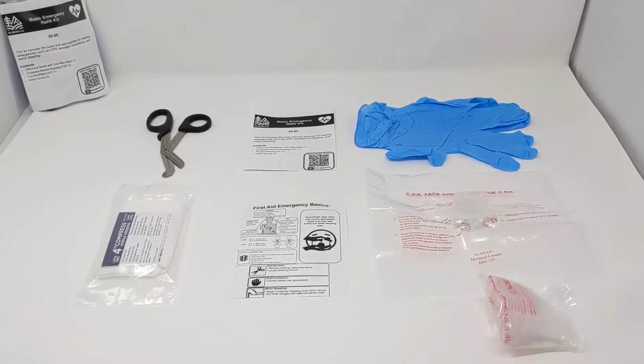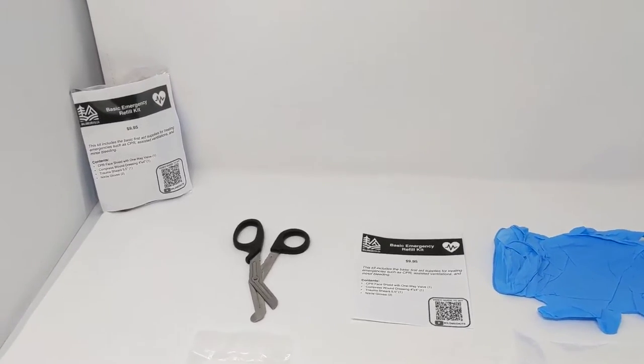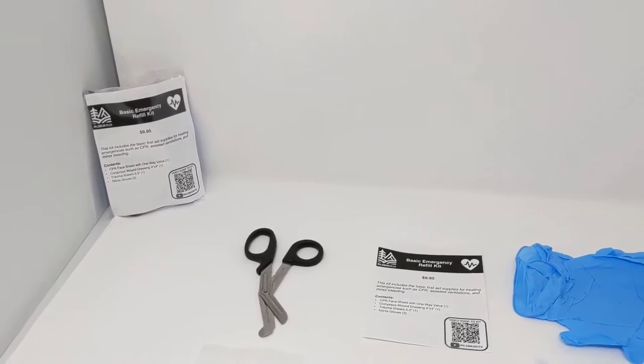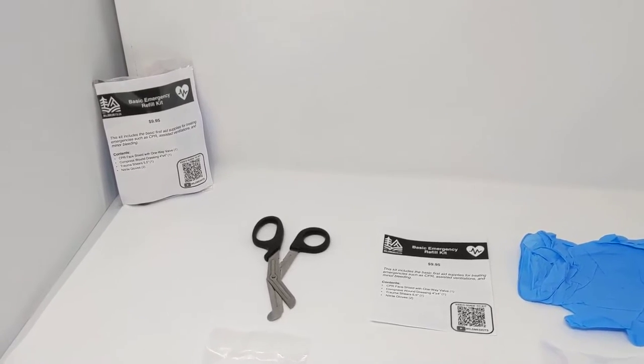This is our basic emergency refill kit. This is designed for the first aider to have a small portable kit that either you can add to an existing first aid kit, carry on your own, or restock tools that you've used.